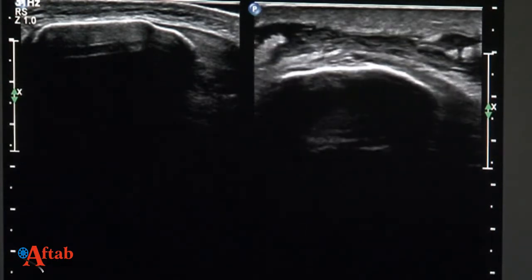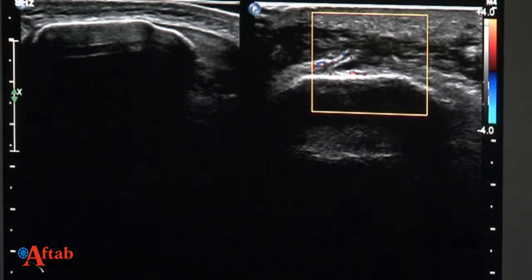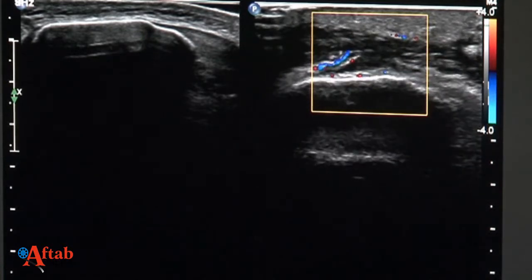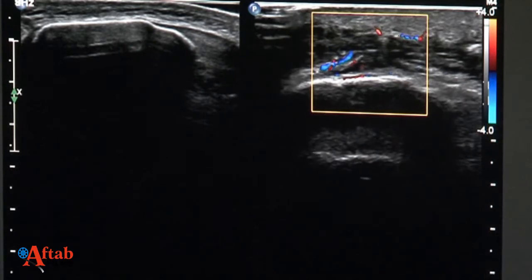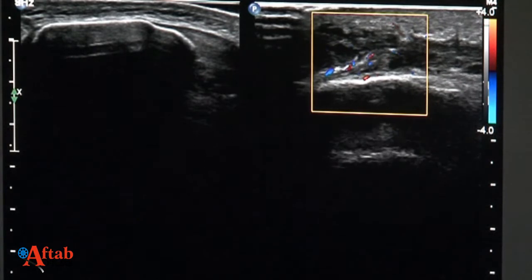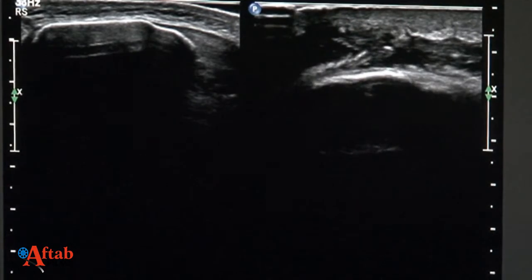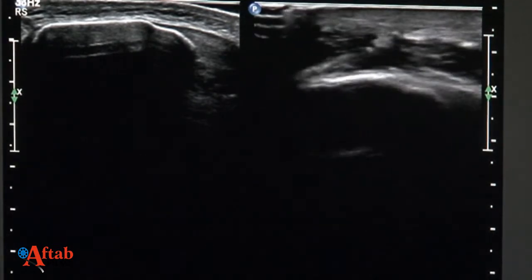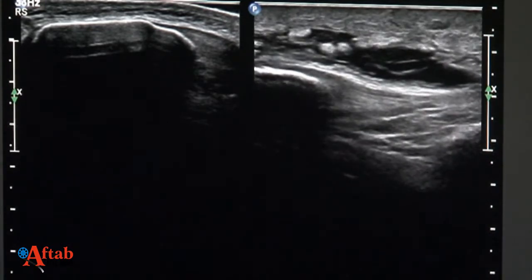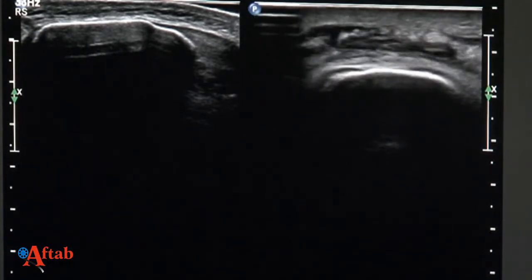That brings me to the thought: are we dealing with synovitis in this region? Yes, we are picking up a lot of vascularity. So this is not only a prepatellar bursa effusion, but prepatellar bursitis with synovial proliferation, and that's the reason we were unable to completely displace that fluid. A clear fluid would always be very happily displaceable and compressible. This is compressible, I can compress it, but I can't displace it. Why? Because there is a lot of synovitis.